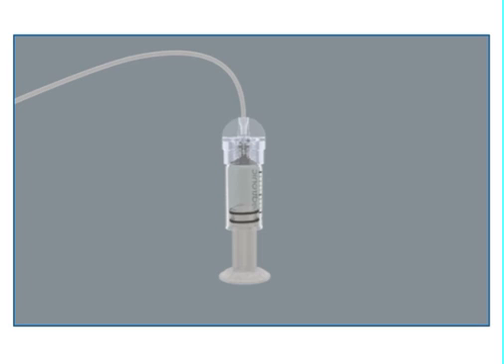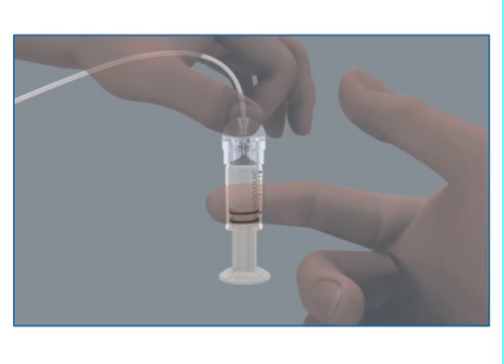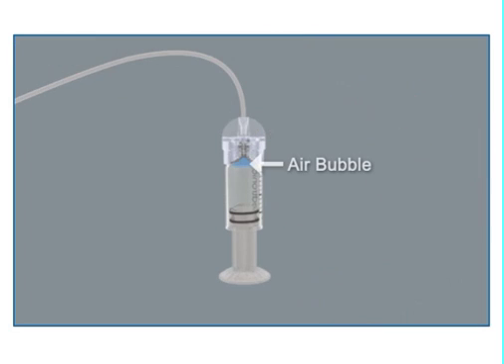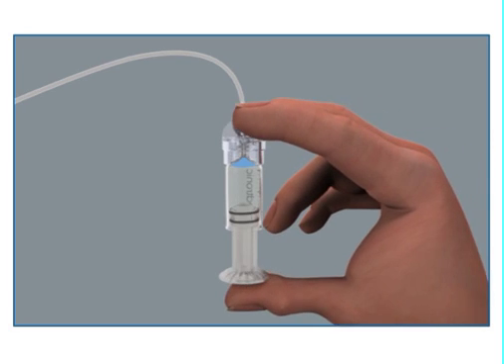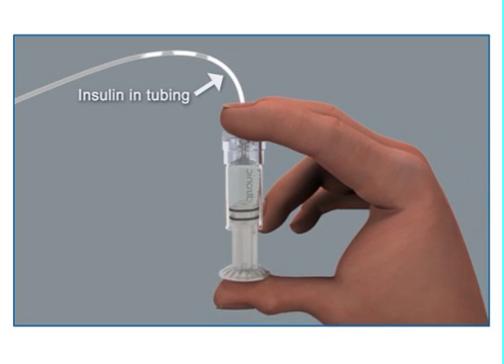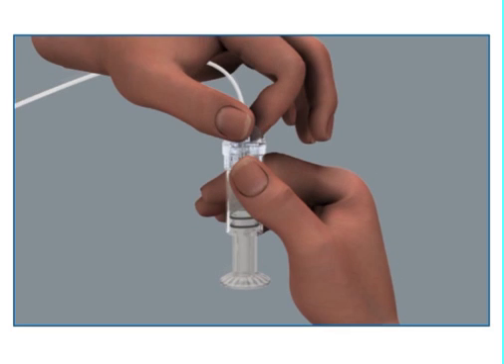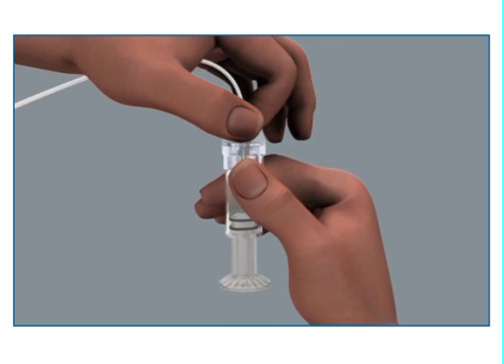You should not have the infusion set inserted into the body when doing this step. Tap the reservoir to make any air bubbles rise to the top. Purge the air bubbles by slowly pushing up on the plunger until all of the air bubbles have been pushed out and you see insulin in the tubing. If you are not able to push insulin into the tubing, disconnect the tubing connector and then reconnect it.